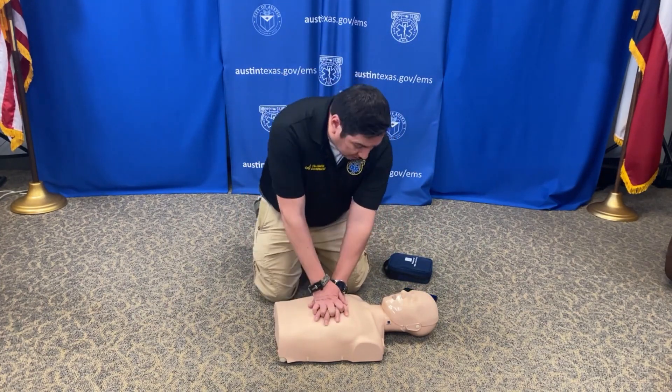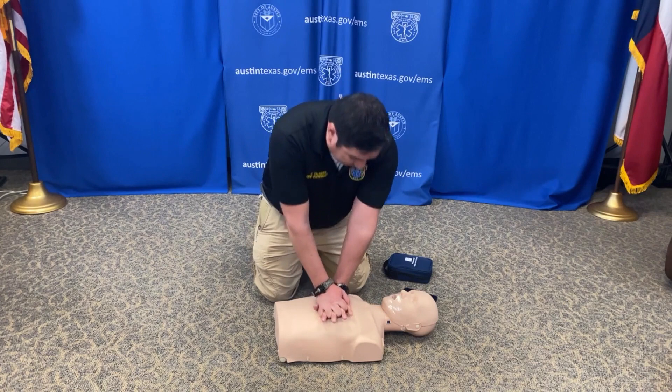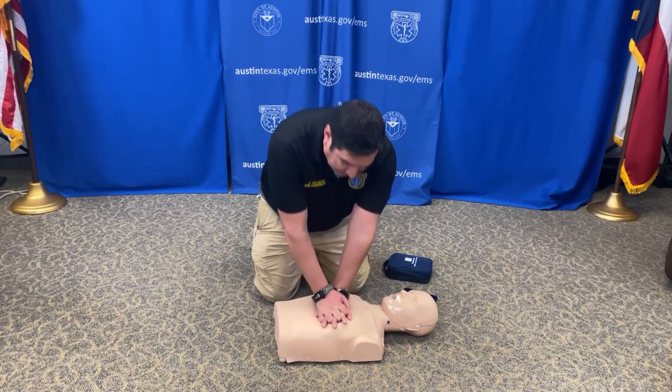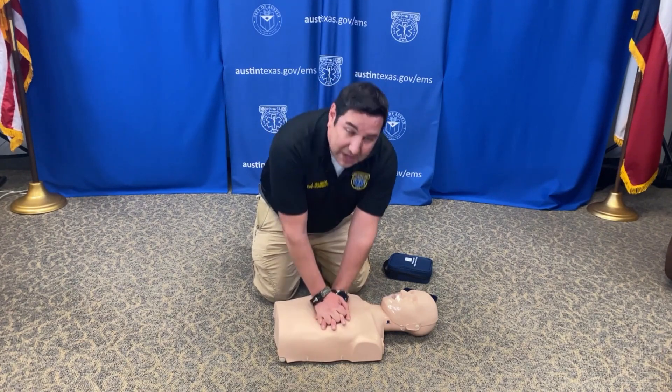They're going to have you start with your hands right in the middle of the chest — right here at our nipple line on our mannequin. Both hands on the chest, keep your arms straight. You're going to go about two inches deep and go as hard and as fast as you can at a rate of 100 to 120 beats a minute.